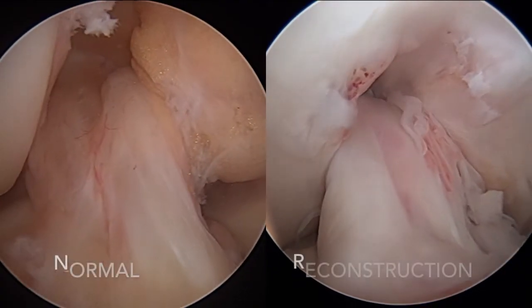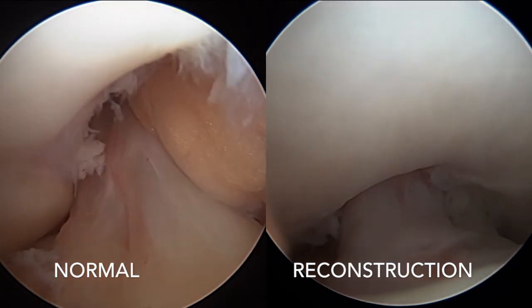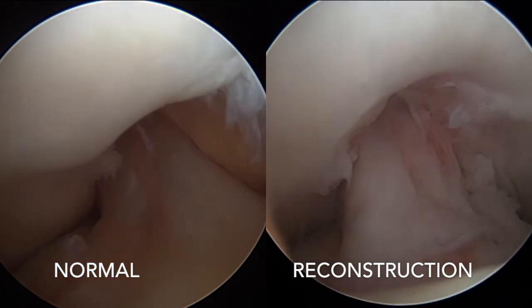Now side by side we can see the reconstructed ACL looks very similar to a normal ACL at the point where the athlete is beginning to progress to sports.